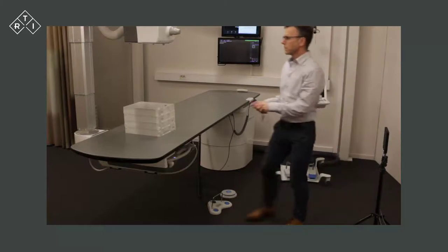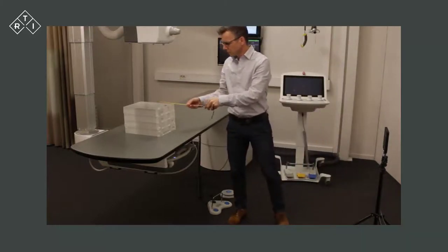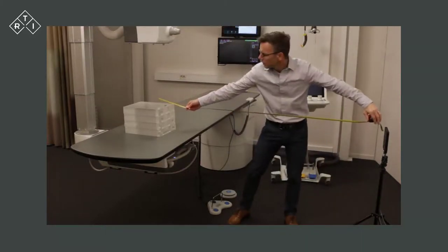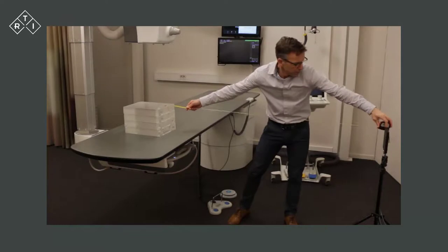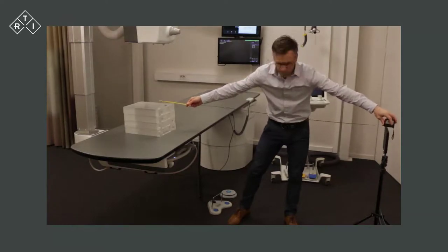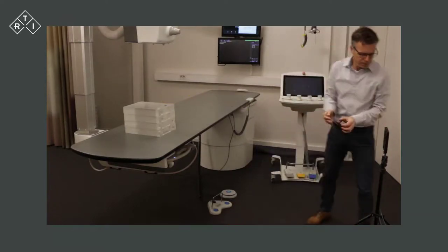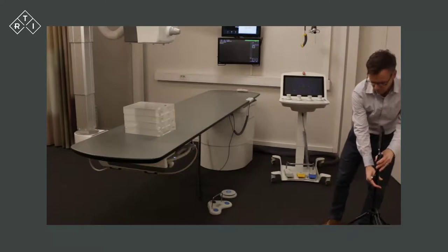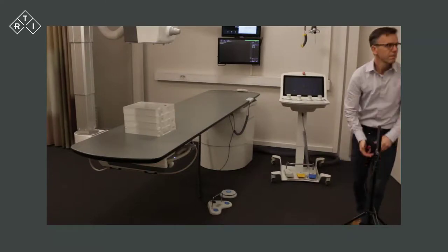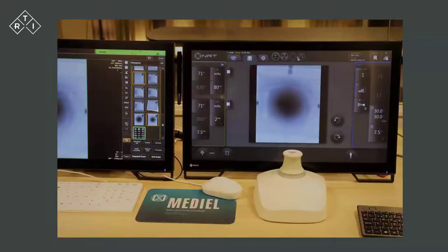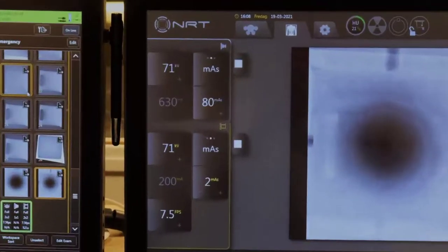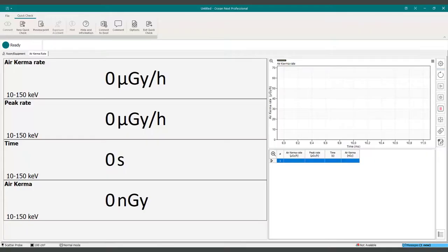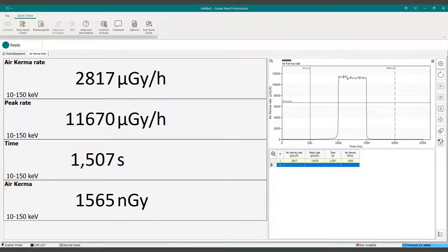Measure the distance to source in case you need to recalculate the dose to another distance using the inverse square law. Set a suitable technique on the console and expose. Repeat this for other relevant locations.